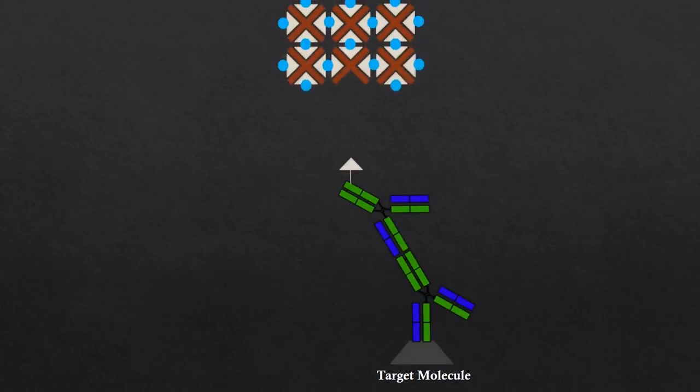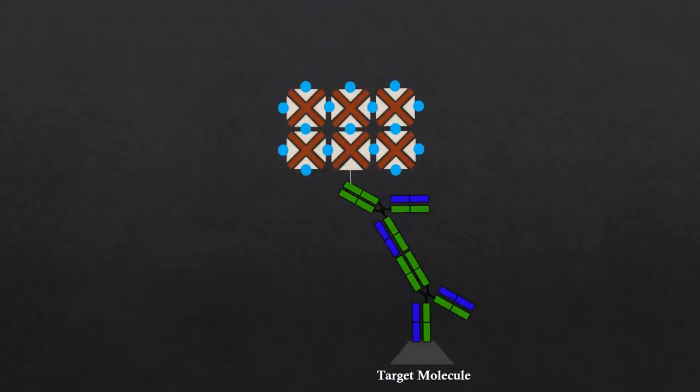Certain issues related with polymer-based immunohistochemistry led to the development of catalyzed signal amplification, or CSA. In CSA, we begin by completing the normal avidin-biotin procedure that was discussed previously. Another complex is used to add staining close to the target molecule. Another protein like avidin, known as streptavidin, is used to make this complex. Labels are added to the streptavidin to make the stain more visible.